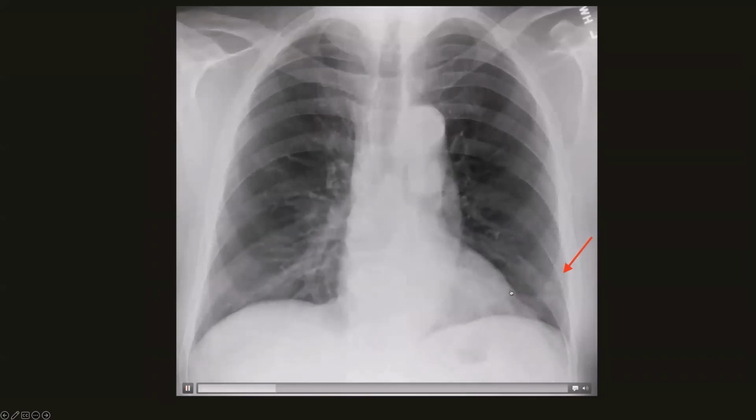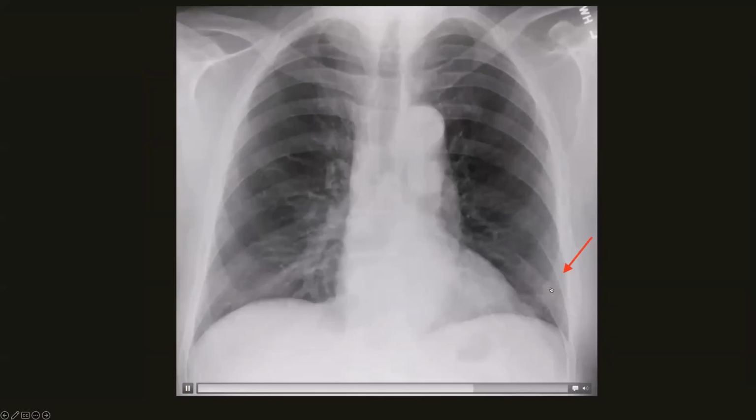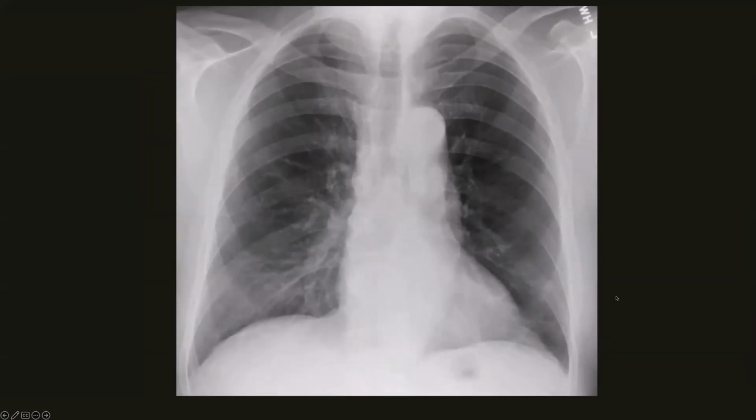This is the corresponding case of a chest wall nodule. You can see here that the lung parenchyma is moving up and down while this nodular opacity here, projecting at the left lung base, is actually fixed relative to the chest wall, suggesting that this was a chest wall lesion, and most people would probably question that as being a nipple shadow, and that was confirmed.